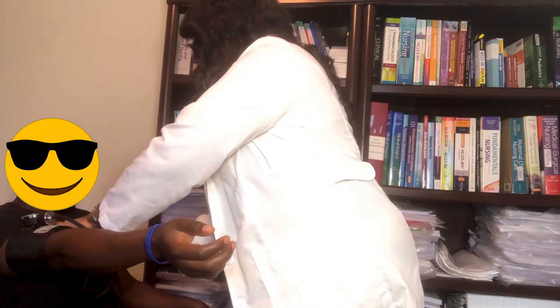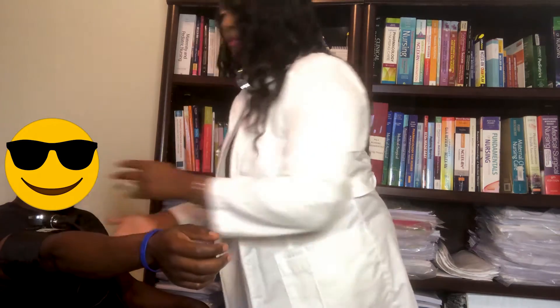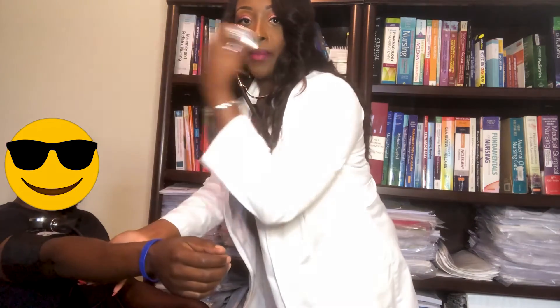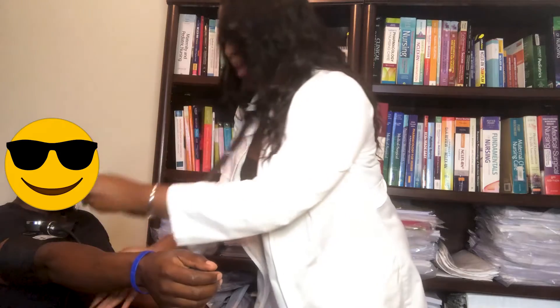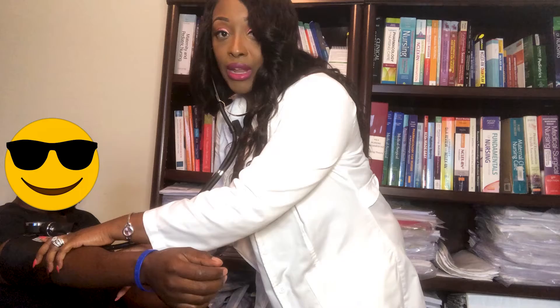After I've secured the cuff around the patient's arm, I'm going to put on my stethoscope and place the diaphragm right in that antecubital space. When the patient flexes their arm, that middle space is the antecubital space, and I'm going to put it directly over the artery because that's where you can hear it the most.